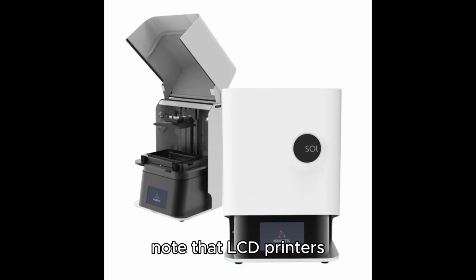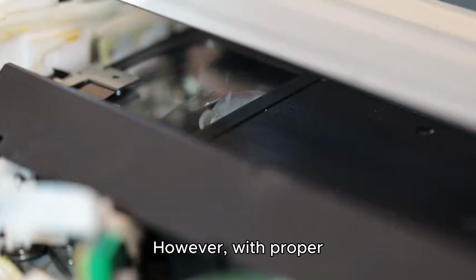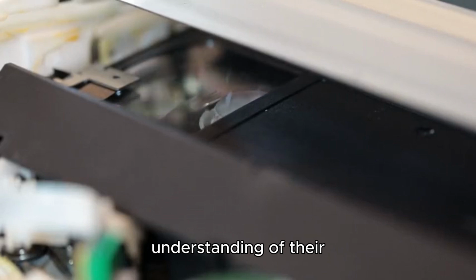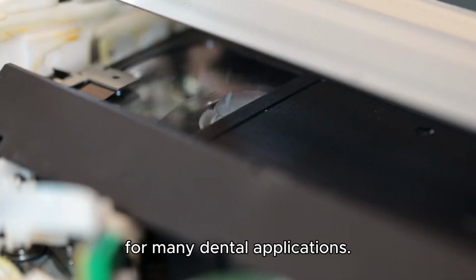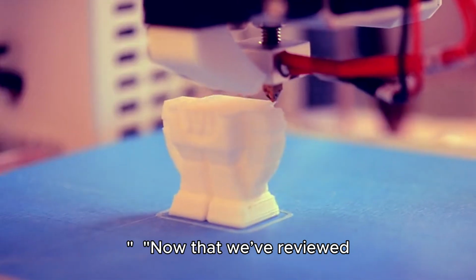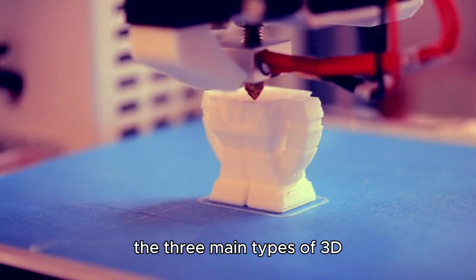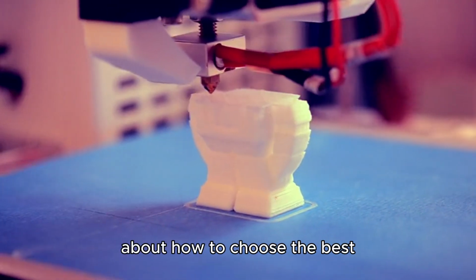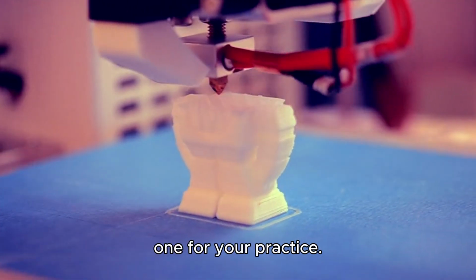It's important to note that LCD printers tend to have shorter lifespans than SLA or DLP due to their reliance on LCD screens, which can degrade over time. However, with proper maintenance and a clear understanding of their capabilities, LCD printers can be an economical choice for many dental applications. Now that we've reviewed the three main types of 3D printers used in dental applications, let's talk about how to choose the best one for your practice.